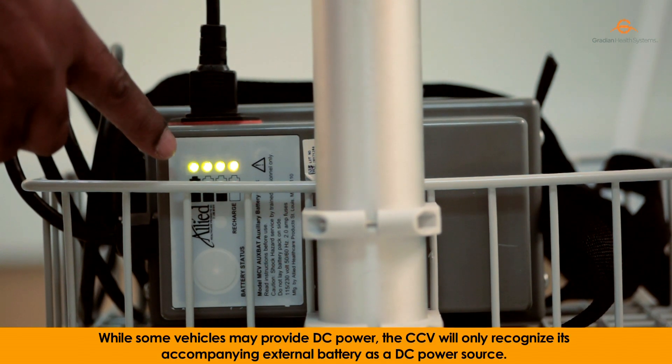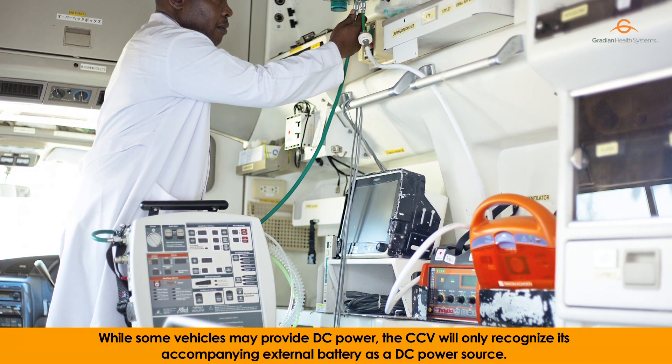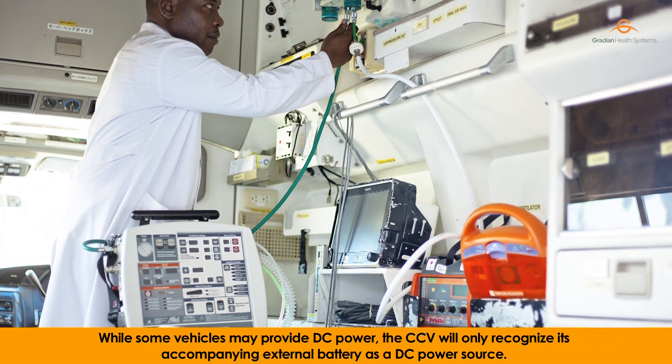While some vehicles may provide DC power, the CCV will only recognize its accompanying external battery as a DC power source.